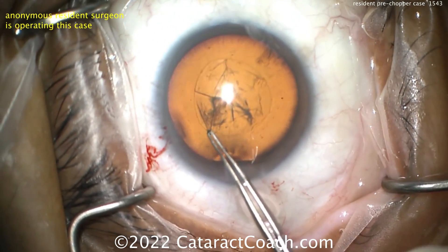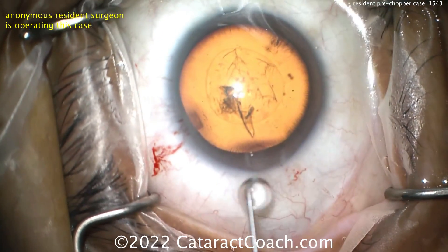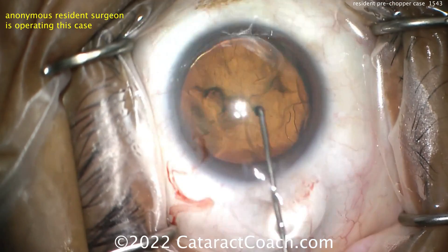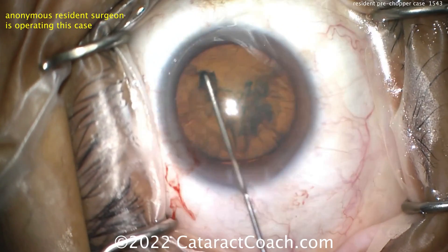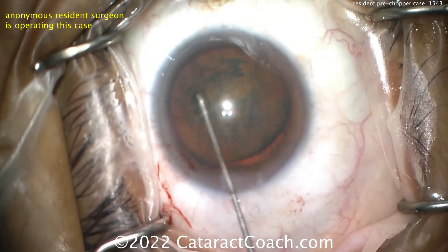There's the CCC — looks pretty reasonable, maybe a little on the small side. Now some hydrodissection using a specialized cannula. Good hydrodissection is essential with a pre-chop technique — you want that nucleus to rotate. Remember: if it does not spin, you will not win. Make sure it spins.